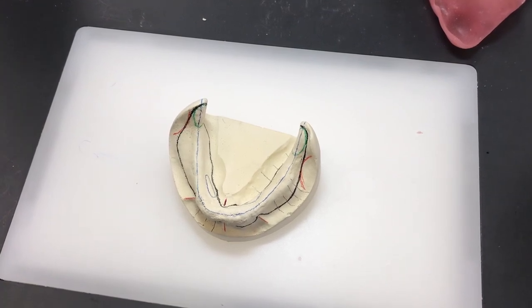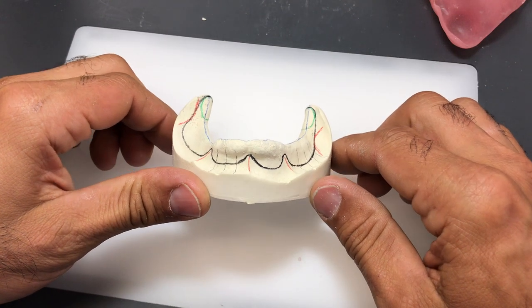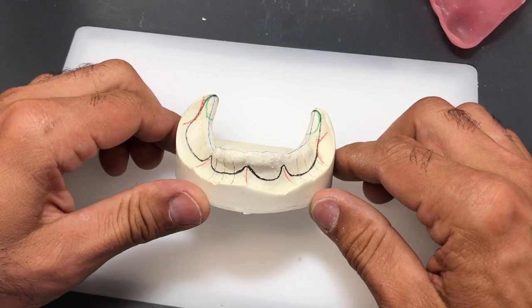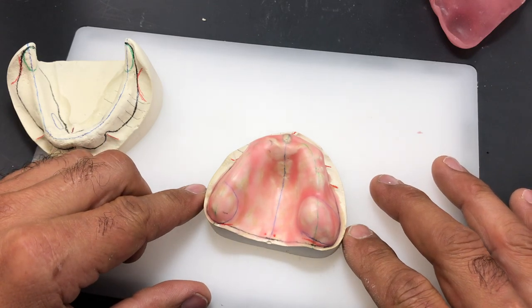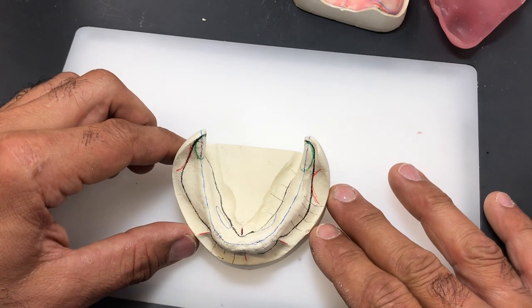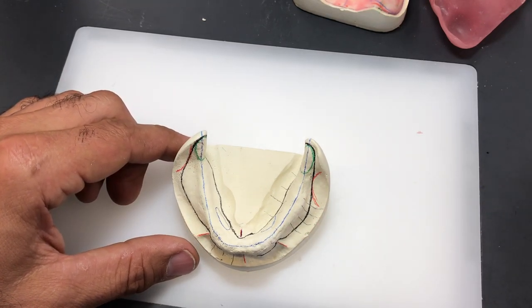So for the lower model, we're going to block it out in the same fashion as we did for the upper cast. The only difference is for this model, because we're going to be using a wax spacer relief, we're not going to apply that fine layer of wax as I did for this one. We're still going to block out the visible undercuts, but then we're going to do something a little different.